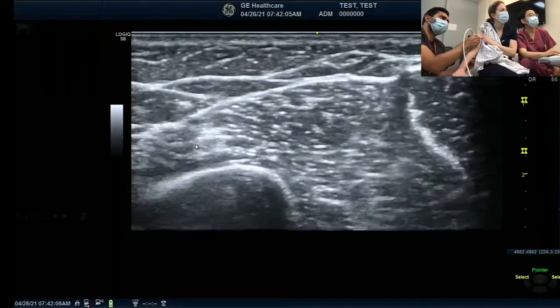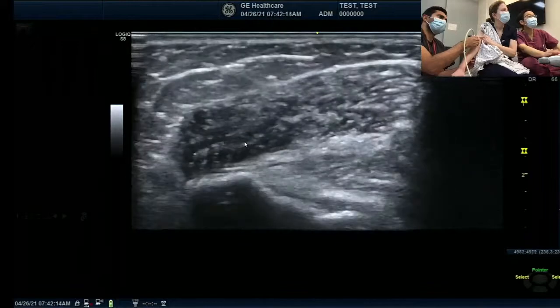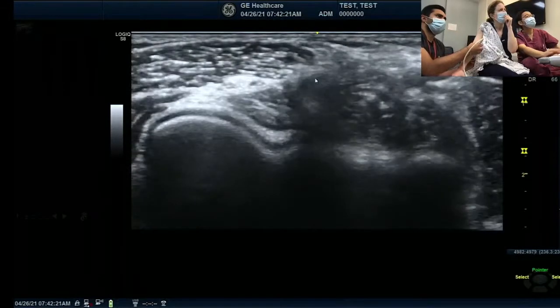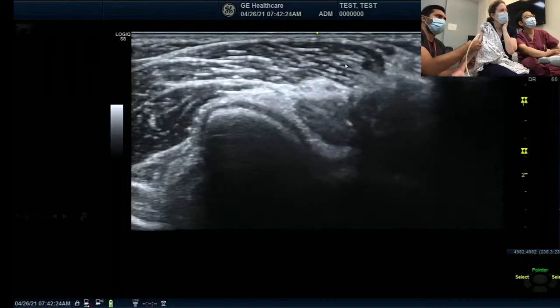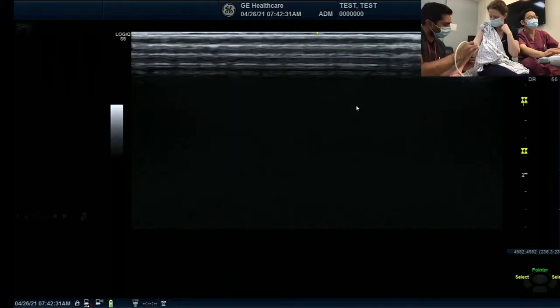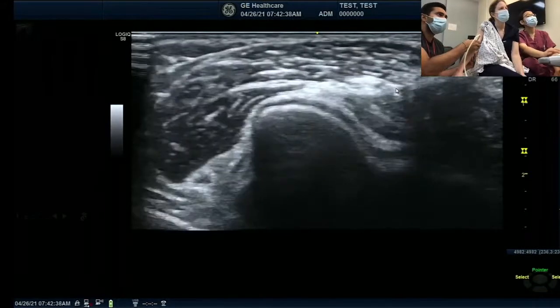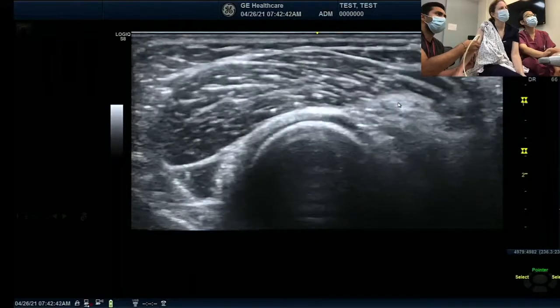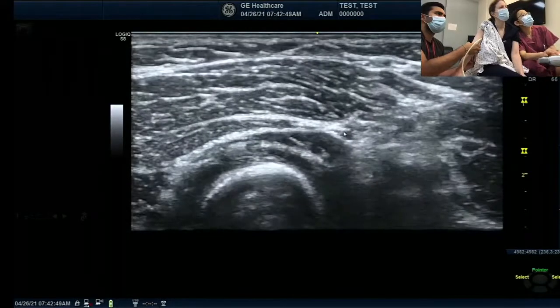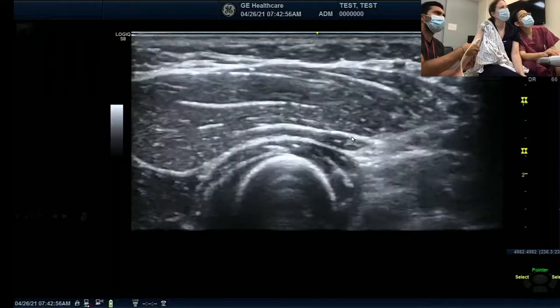Above the elbow. Let's go down to the elbow joint. Elbow joint here. And then we are following this one, right? Between the brachialis and ECRL, but let's follow this one continuously. Okay, come down in between. Looks like now you are better. Yeah, now stay here. It also dives deep, right? Oh, it's still going too deep.